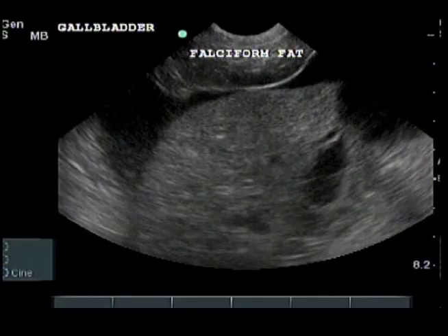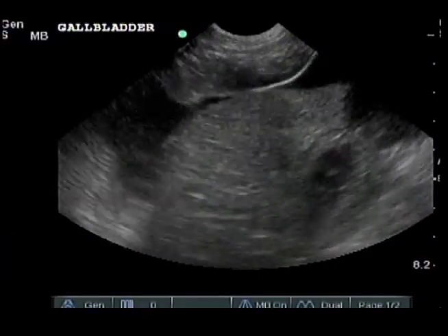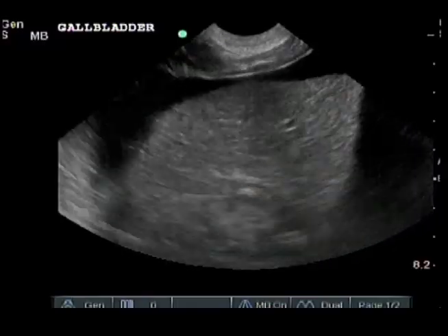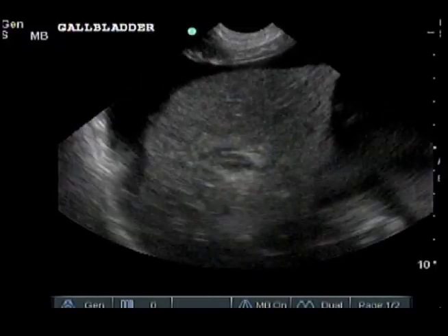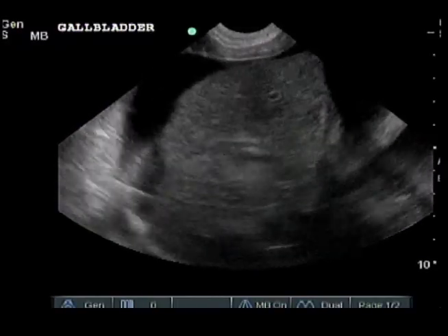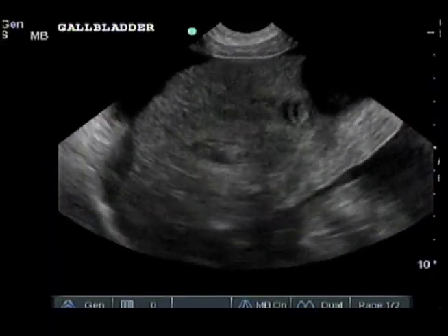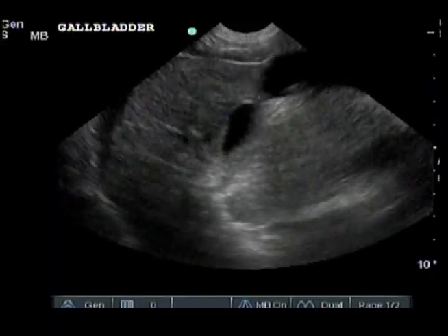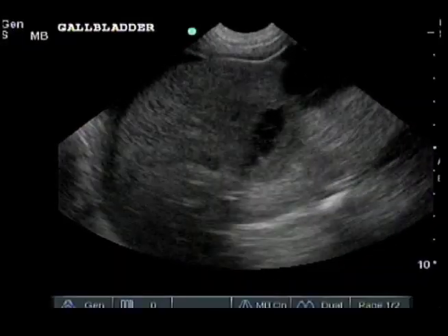We have completed a general abdominal scan. We studied transducer movements to find organs, evaluation of organs, landmarks, artifacts, and measurements. Now let's do a visual review of the pattern of the general abdominal scan to help you develop visual skills.